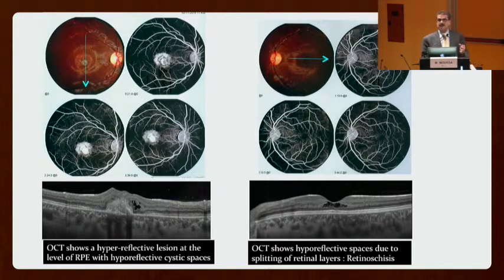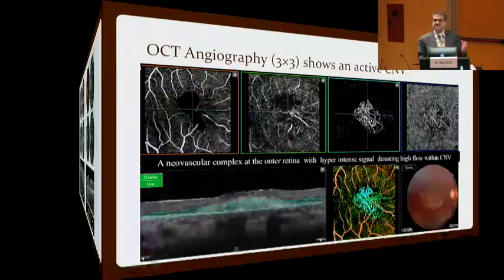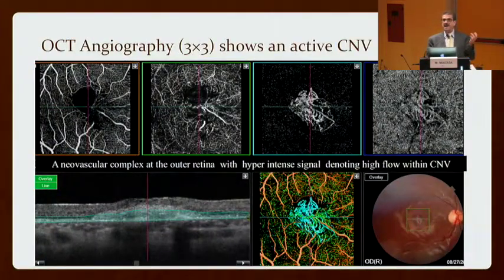To start with, I looked at it and I said, if this cyst belongs to the foveal schisis, it cannot be a CNV. But if this cyst is an active cyst and it is a CNV, how can I start treating without any evidence? And then at that time, 1.5 years ago, I already had the OCT angio in my clinic, and I looked at it. It's a huge CNV, but the regular structural OCT didn't show anything.